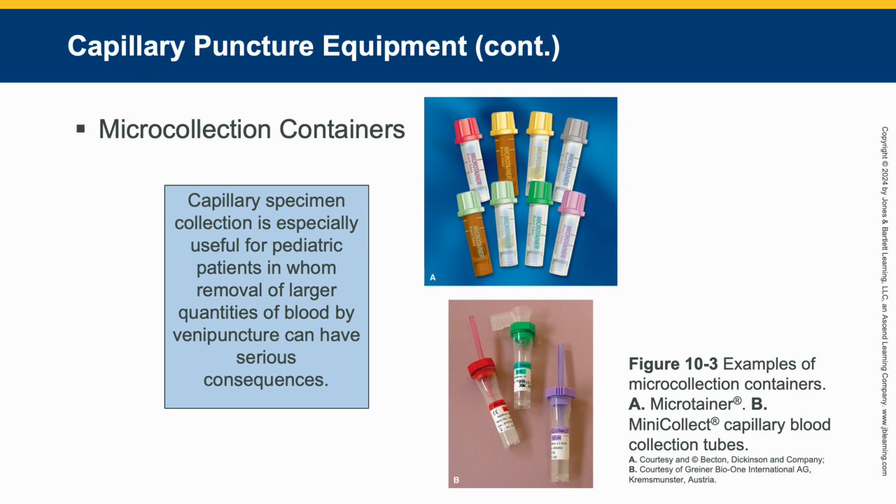Some of them have the lot numbers on the actual tube, but they will also have expiration dates on each tube. So this depends kind of on the manufacturer. Sometimes they put that on the box, but sometimes they have them on the individual tubes.